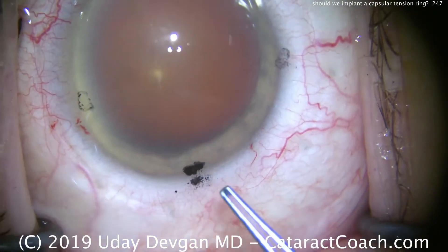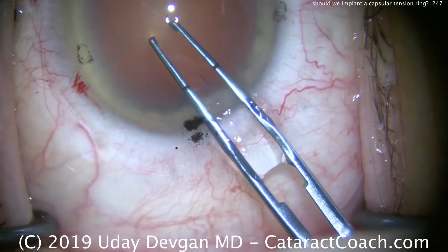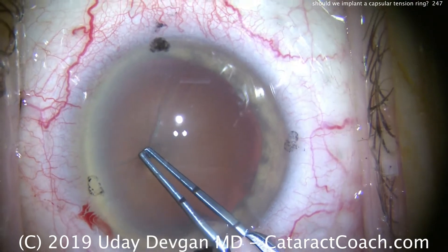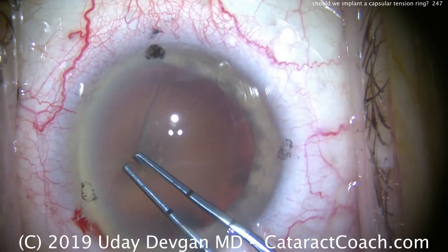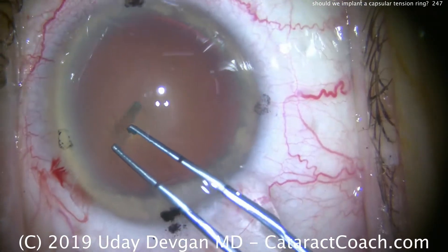Watch carefully. We'll put our forceps in the eye, and look what happens when we attempt to puncture the lens capsule — wrinkling, a lot of wrinkling. It's tough to puncture. We poke it again; it takes three or four tries just to puncture the lens capsule.